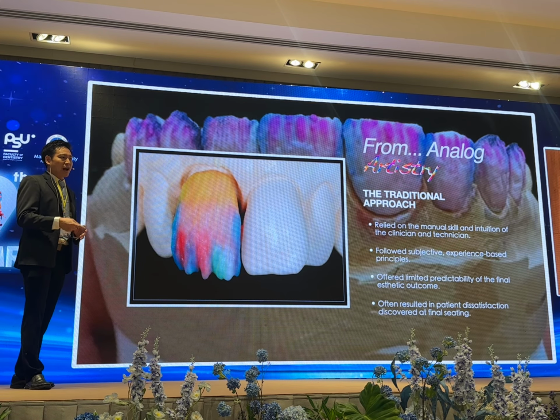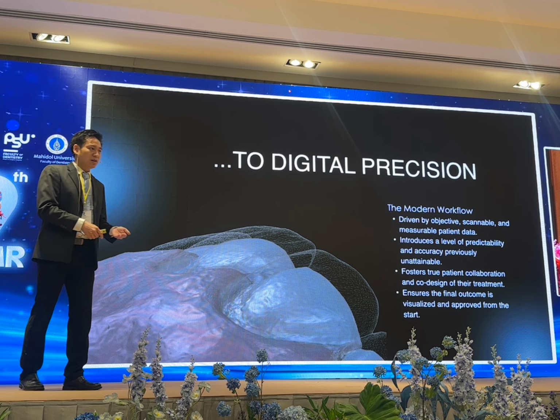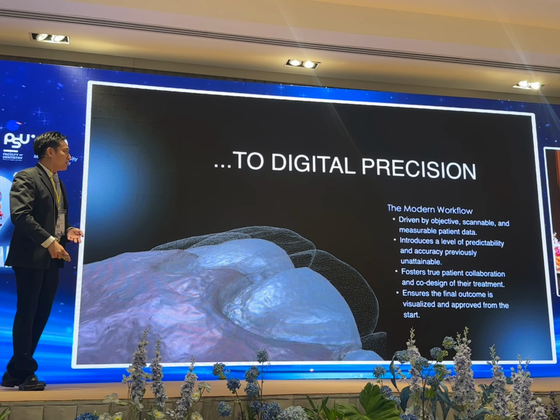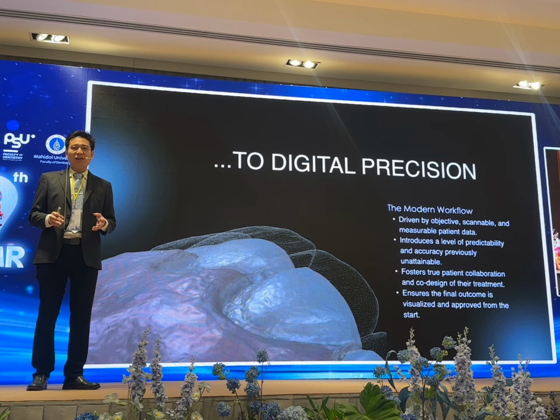So, with the coming of technology, we don't need to rely on the operator that much anymore. We use technology to make our life a lot easier. With digital technology, you can use an intraoral scanner to capture a 3D model of your patient's teeth.